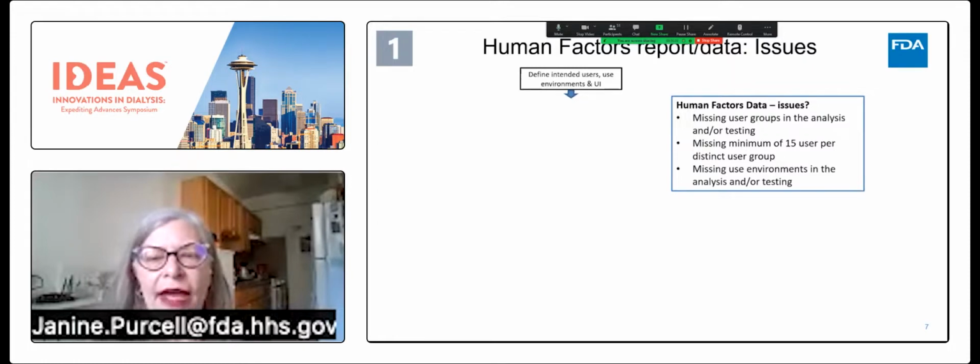And another consideration in bringing a device to market in the United States is that home care is not supported in the same ways as it is in other countries outside of the United States. So you want to really understand the burden of tasks and understanding of your device that in many cases is going to be a higher bar and more burdensome for a person using these technologies at home in the United States because they may not receive the same level of home care visits by nursing or other healthcare providers to help with them administering home dialysis.